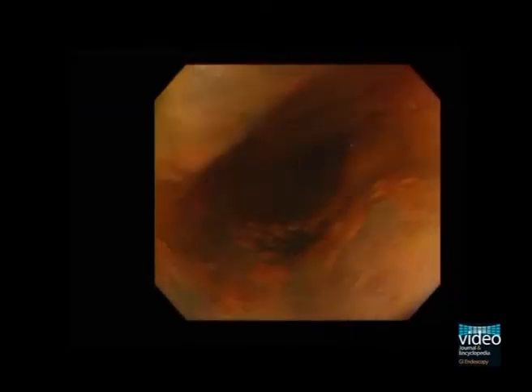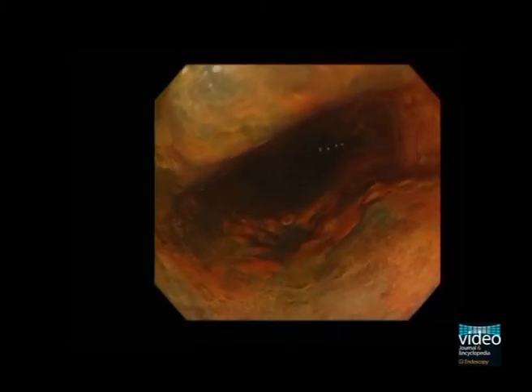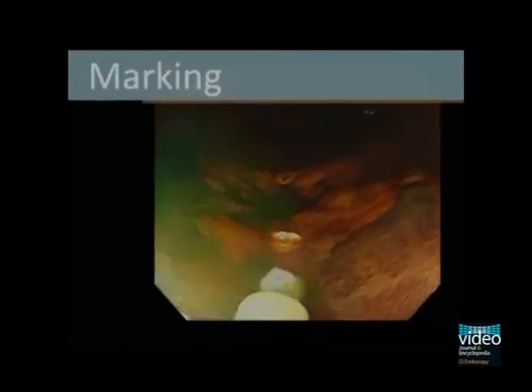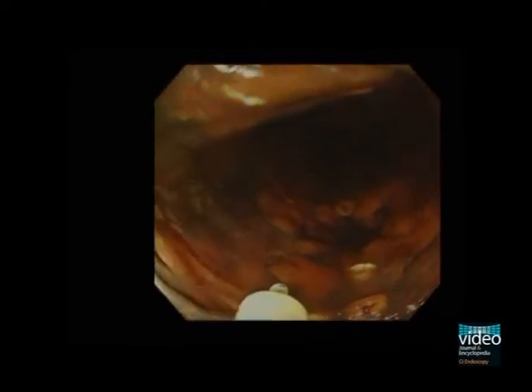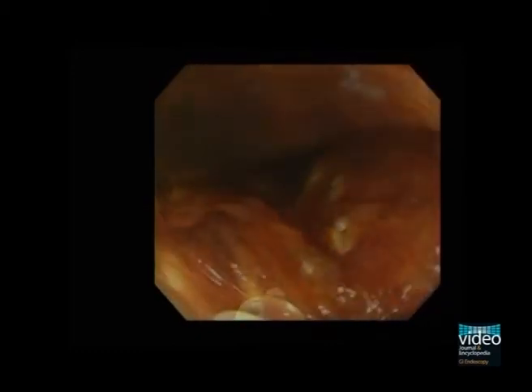After spraying iodine solution, we make marking around the unstained area using the tip of dual knife by soft coagulation mode by an electrosurgical unit. We place dots about 5 mm outside the lesion.